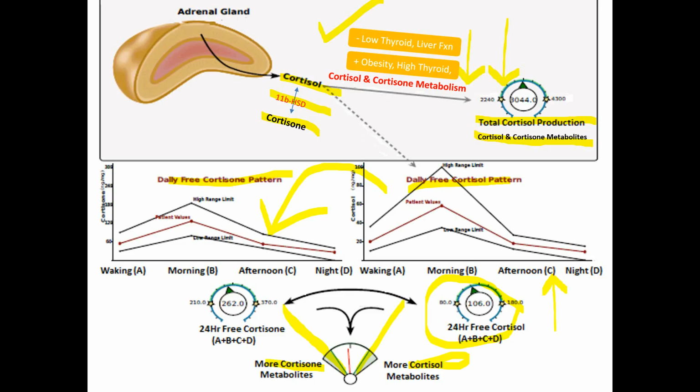In this particular case, where it seems that maybe the cortisol clearance is a little bit sluggish, if the cortisol is pointed more in this direction, maybe even more reason to take a look at the thyroid function, because what the literature would suggest is that if you have low thyroid function, what you can get is the cortisol staying in its active form, not being readily deactivated, and also you get somewhat sluggish or lower cortisol clearance, which is kind of the look that we have in this particular case.